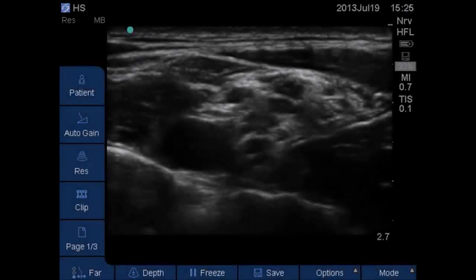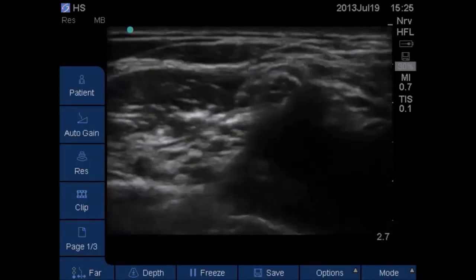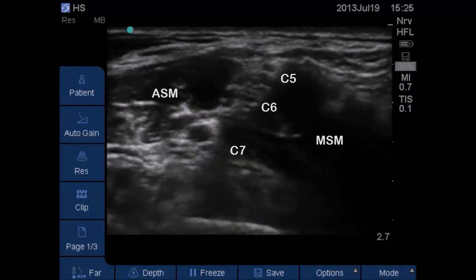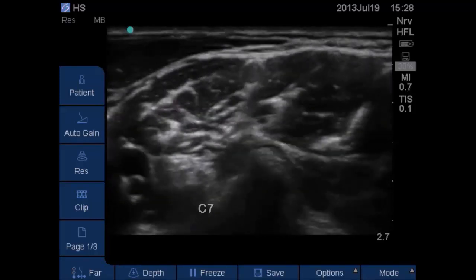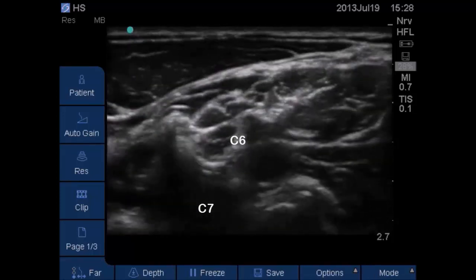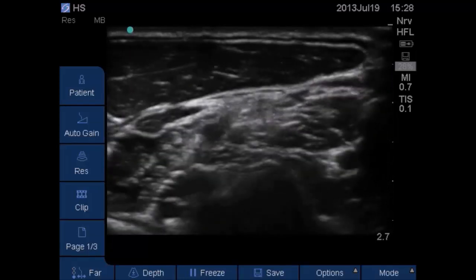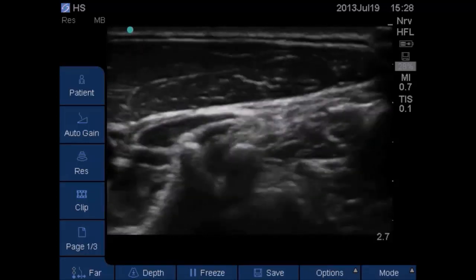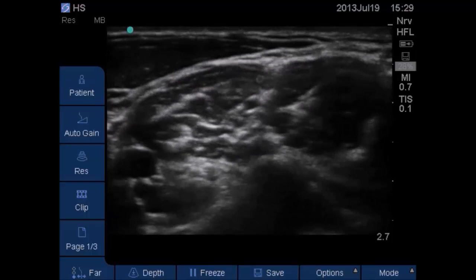Here we have placed the ultrasound probe at the supraclavicular level identifying the subclavian artery and the brachial plexus superolateral to it. As we move the probe proximally, the C5, C6 and C7 nerve roots can be seen between the anterior and middle scalene muscles. Each nerve root can be traced more proximally to its vertebral foramina beginning with C7, then C6 and C5. A distal scan demonstrates this better as C5, followed by C6 and finally C7 nerve roots can be seen to emerge and line up between the scalene muscles.